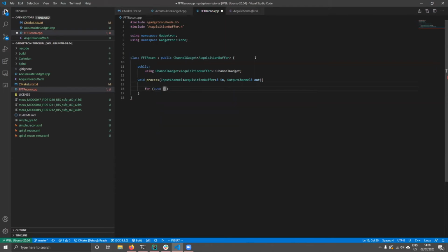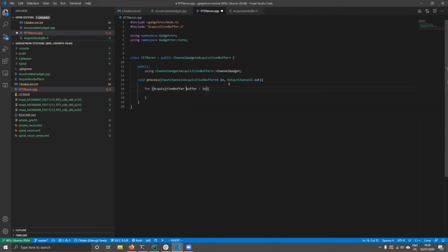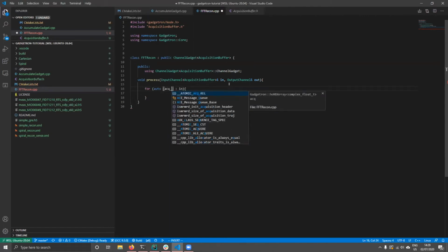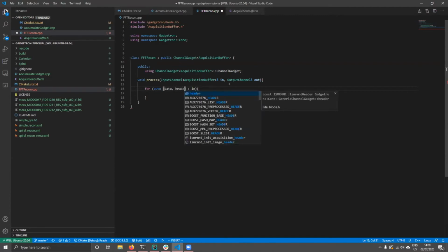Now, our acquisition buffer consisted of some data and some headers, so we can unpack those in the for loop. Like we don't have to do this at all. It's just here for convenience. You could also just have, so this line could be acquisition buffer instead, if you prefer a little more old school C++. Data and headers.